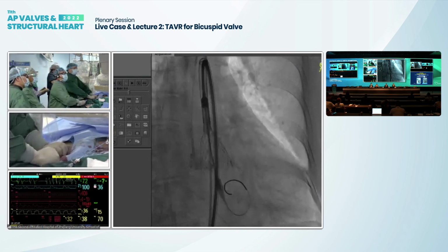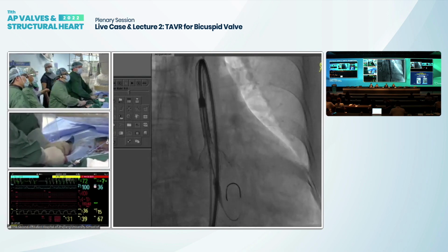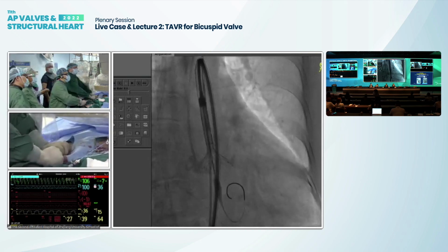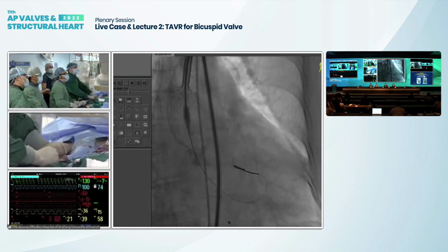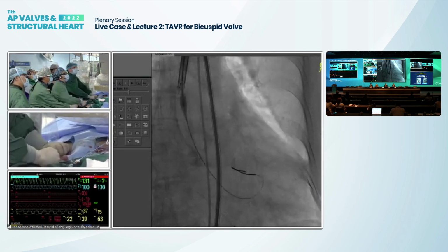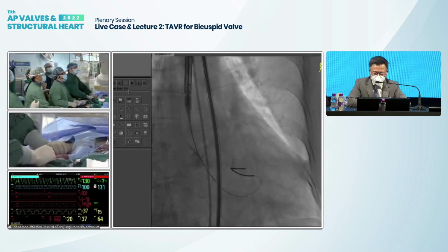So you're going to retrieve it completely, right? Yes, completely. Otherwise you can't really, you kind of stay stuck where you were. I think pushing the stiff wire a bit maybe helps you to be more coaxial.